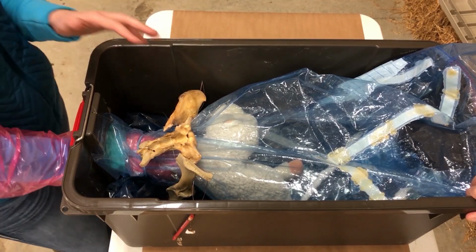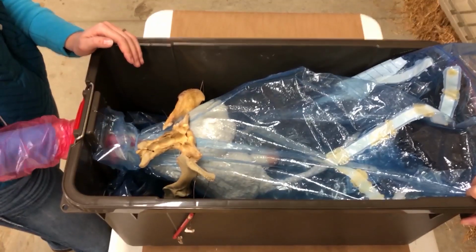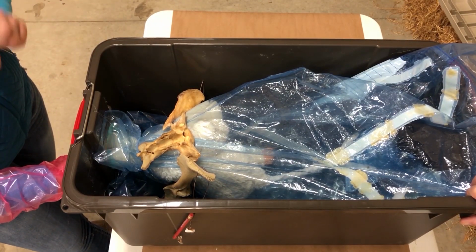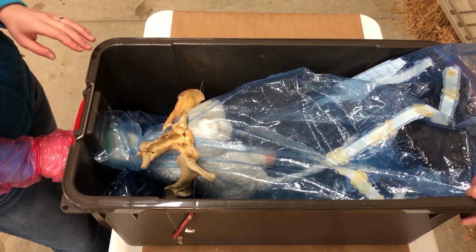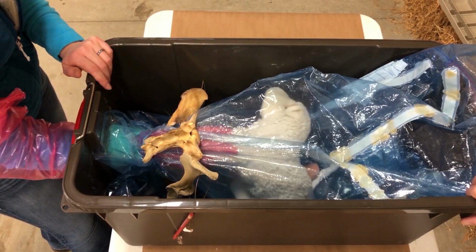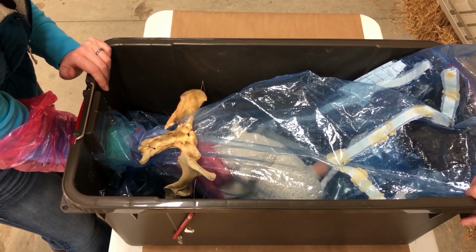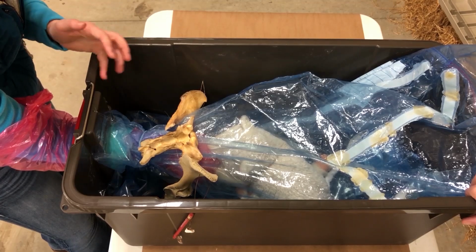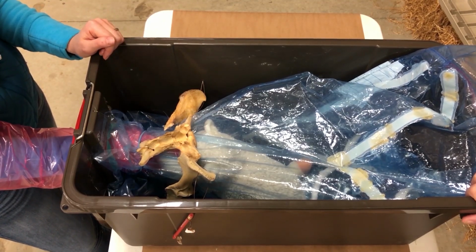So a good practical solution for this is, if we have the legs and we can get the legs actually outside of the ewe's body, this is a good time to use some twine or rope. Get some strings attached to those before you push them back in. So you're going to push them back in and then pull this head down as much as possible. Get both of those legs, which you should be able to find pretty easily if you've got some twine on them. Once we have all 3 of those again, we are able to deliver it normally.